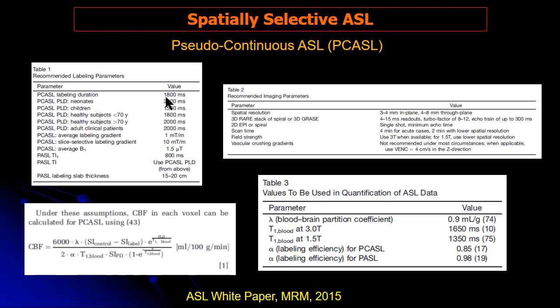In this paper, a detailed description of the parameters for labeling, acquisition, and quantification were provided for standardized protocols across vendors. I think currently all three large vendors have provided PCASL with this kind of parameters as product sequence.